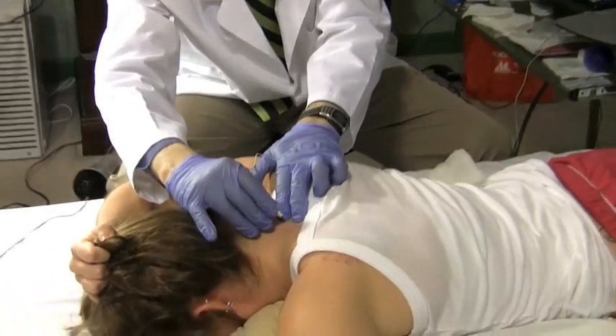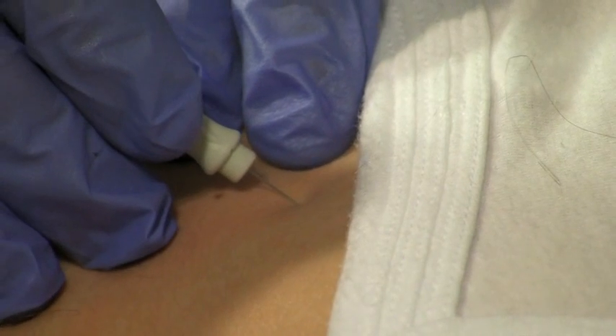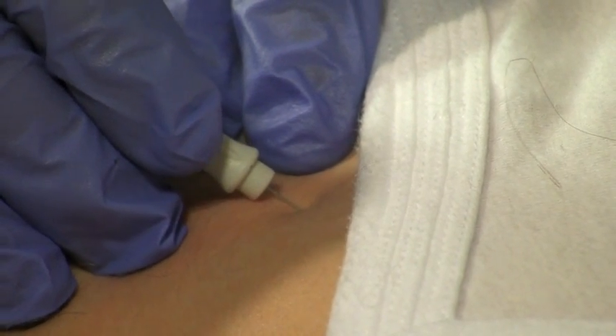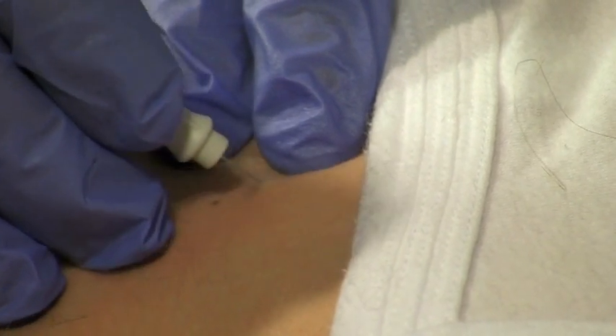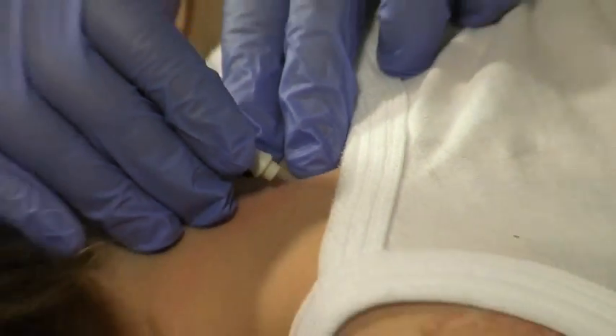C8. Here we go. Relax, put your head down. Perfectly normal insertion activity.